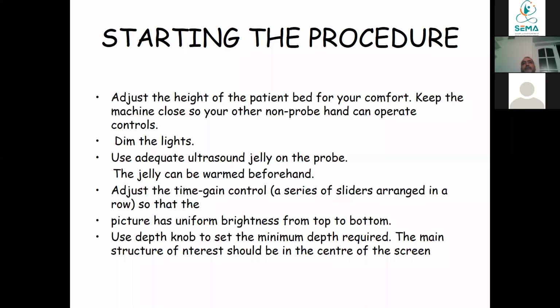Sometimes you need sedation. In the neonatal period, we don't use sedation like chloral hydrate, but if you have a child or pediatric patient, like 1 year old, you can use chloral hydrate. For neonates, we use sucrose here. We give sucrose in every unit, which helps, because crying will generate air in the chest, and air is the enemy of ultrasound.